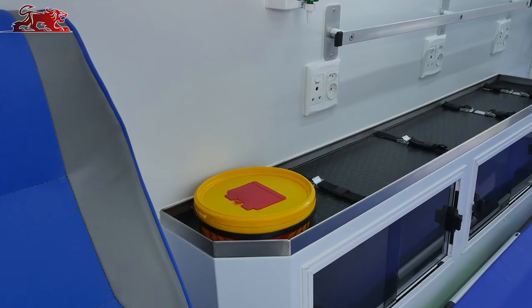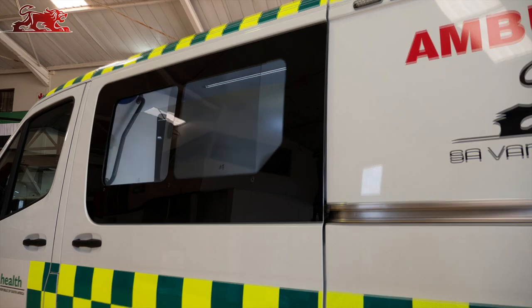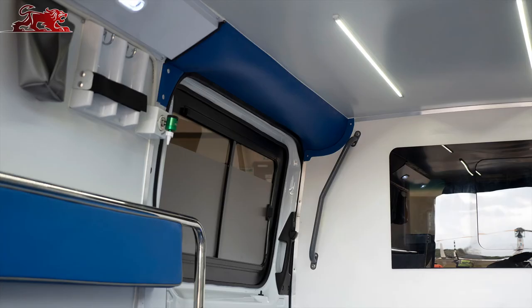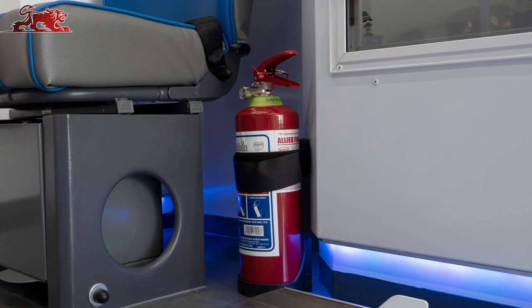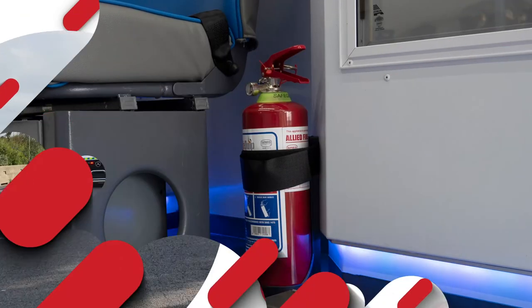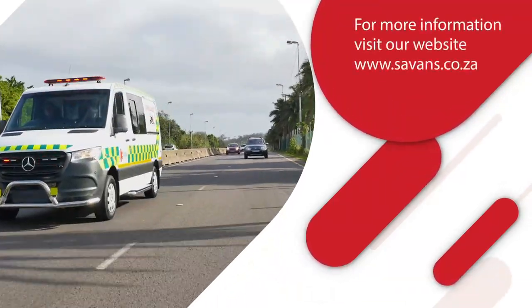A highly effective ultraviolet air sanitizer. Intravenous fluid holders with support straps. Dedicated provision for medical sharps container. Bonded glass with sliding windows and privacy frosting. Grab handles and head bump protection at the side sliding and rear entry doors. And a 2.5 kg dry powder fire extinguisher. For more information, contact SAVAN Conversions or visit our website.